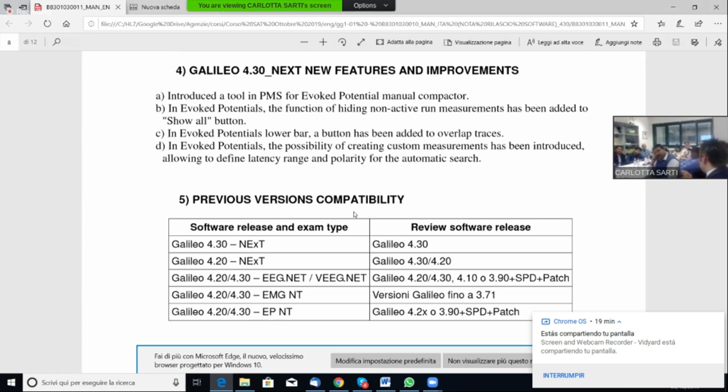You can modify the filter inside your bandwidth, but you can't destroy the whole and recreate your examination. In our software, yes, you can. But this is a little problem, because we always record the raw data. It's a very, very big file that you need to manage.